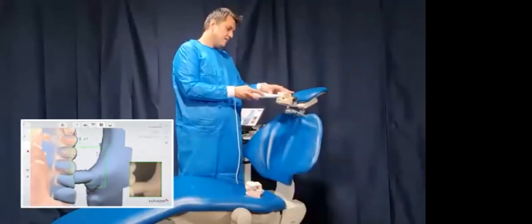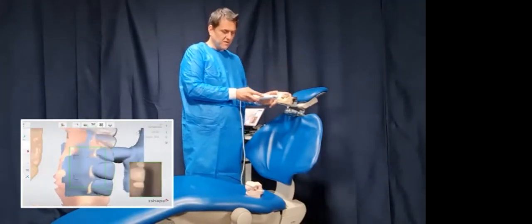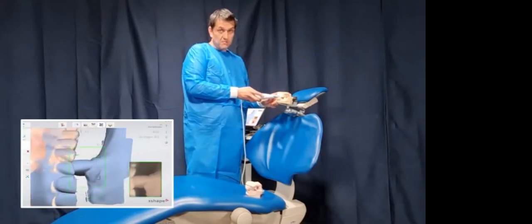Now when I come back, I start to roll down and I want to catch some of the lower mucosa, because I've already scanned this. I want to catch some of that lower mucosa as I come down. So I'm moving my way back and I'm rolling my finger. Okay, thank you, Mr. Cameraman. And back around. Now I'm coming around to the midline, so you can see my hand position now. Obviously I don't have my hand inside the head, but it will be here, like so. And again, I'm still supported here. My thumb is still supporting my scanner, and I'm coming to the midline.